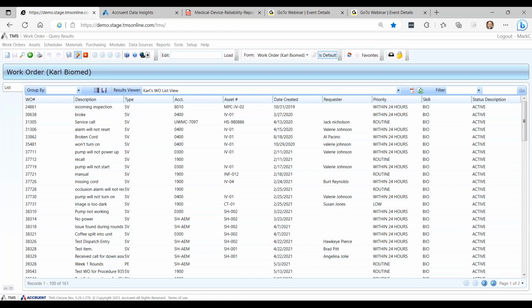So you might get a new department head that says, hey, what are you currently taking care of for us for AssetWise? They can go out there and run these queries in the system. The modules that are involved in TMS, much like in any modern CMMS, include your assets and your work orders. So we have our corrective. You can have different work order types. Anytime there's a drop down in TMS, you can make those specific to whatever segment or account that you're currently in.